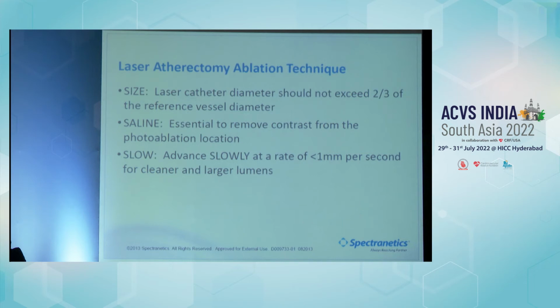And in fact, with more experience, they say that if you are not able to burn or you are not able to get the desired result, you can use contrast with laser ablation, but that's only when you do more than 100 cases. When you have more experience with how to use the laser, you can use the technique.